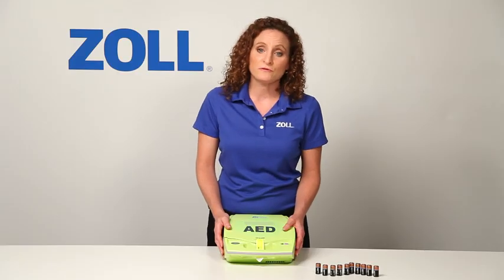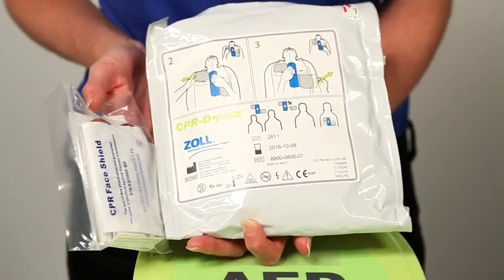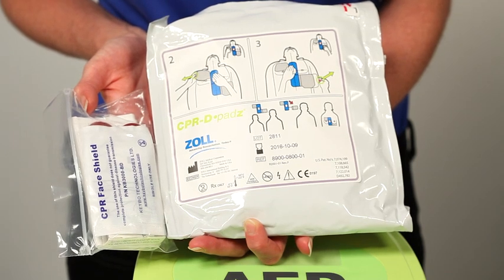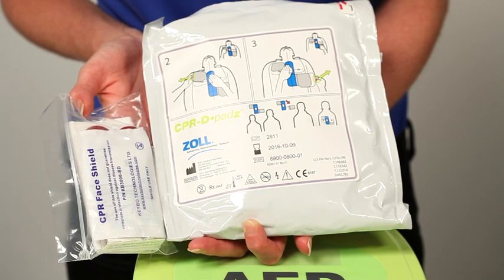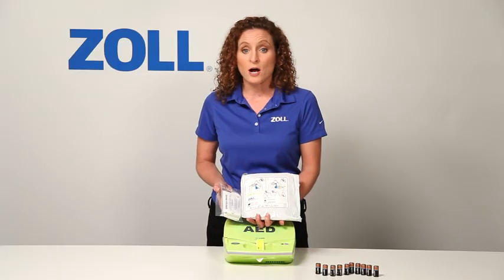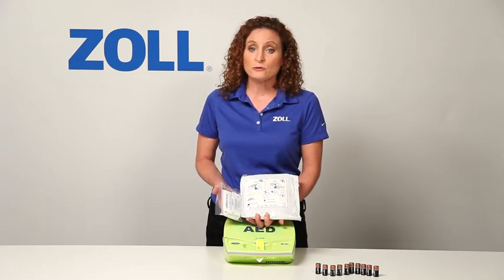Every CPR-D pad has a rescue accessory package attached. It contains items you may need in a rescue, including scissors to cut clothes, a razor to remove hair, a paper towel to wipe off the chest if the victim is wet or sweating, a pair of protective gloves, a barrier mask for optional mouth-to-mouth breathing, and a wet towelette for cleaning up. No other AED includes this sort of support along with every set of pads.